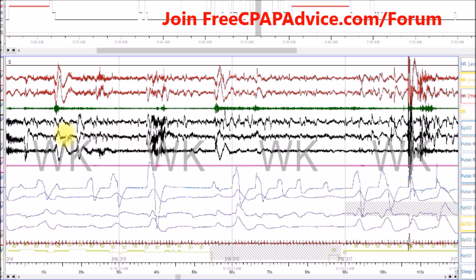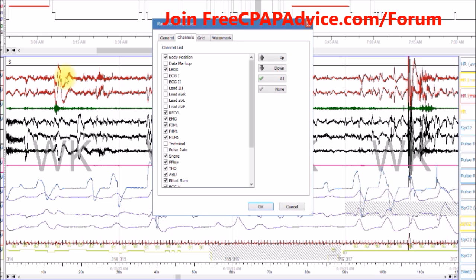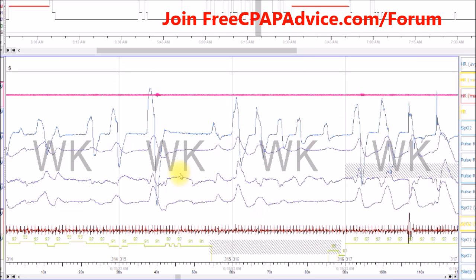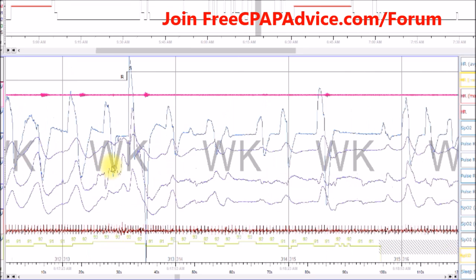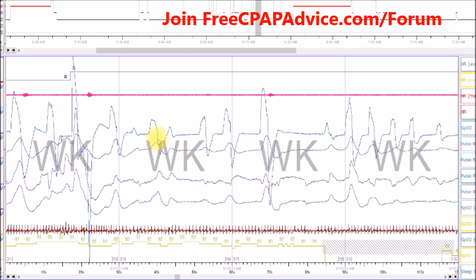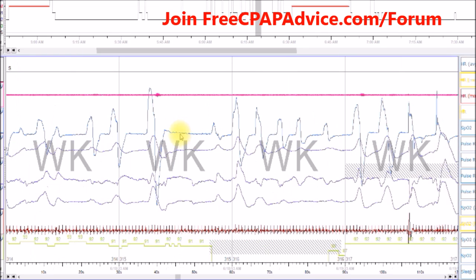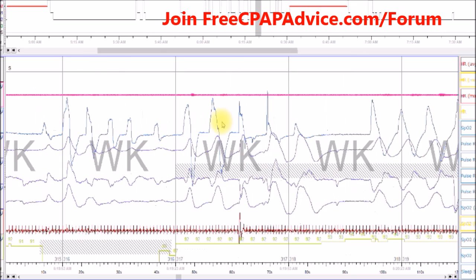We have the luxury of knowing that all of this is wake, but here's what our machines see - this is what SleepyHead sees. You wouldn't have this wake data with your machine, so you'd be looking at it thinking 'oh my god, my sleep is so messed up, I don't breathe at all.' But you might be awake. So if you see these big large spikes, you can almost always be sure that it's not real.